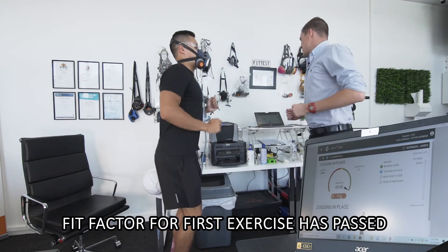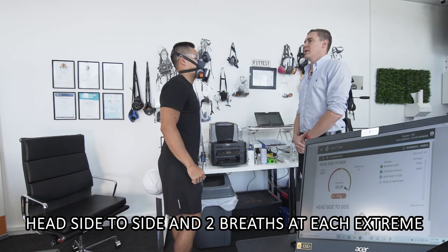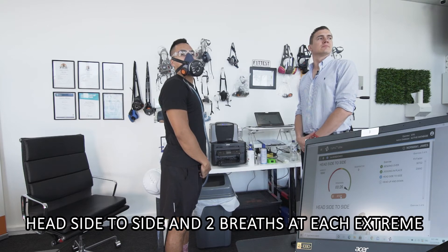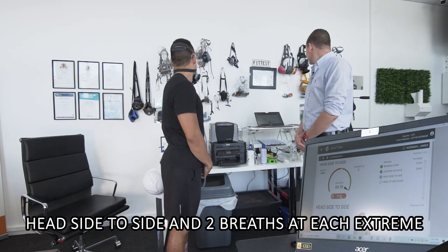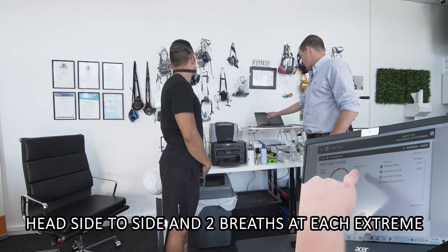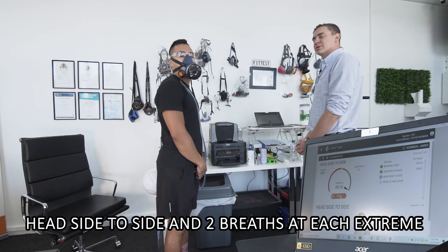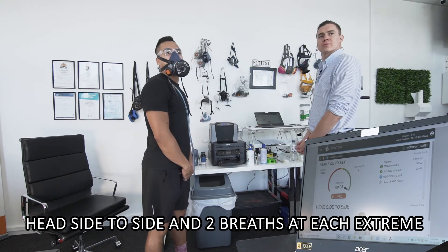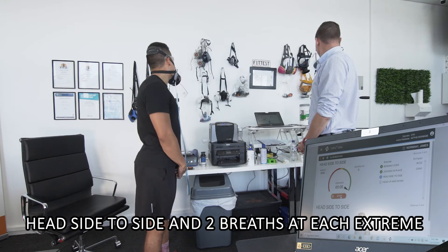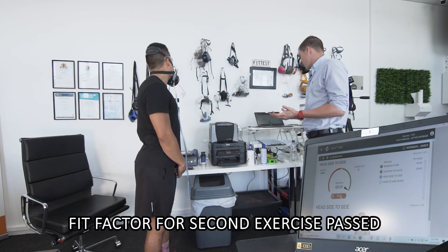Now jog in place — nice and slow, nice and steady, doing really well. You still have 6,849 particles on the outside of the mask and inside the mask you still have zero particles, so it's sealing extremely well. Your first fit factor is over 30,000 — the pass level for that mask is 100, so at the moment you're 307 times the pass level. It's sealing really well. In five seconds we'll go to head side to side — three, two, one. All the way one way, two breaths and pause. And back the other way and pause. Still zero particles getting into your mask, James — really good job, it's sealing really well. Second score is 23,000 — 230 times the pass level.